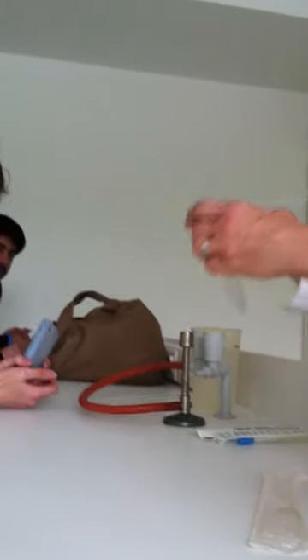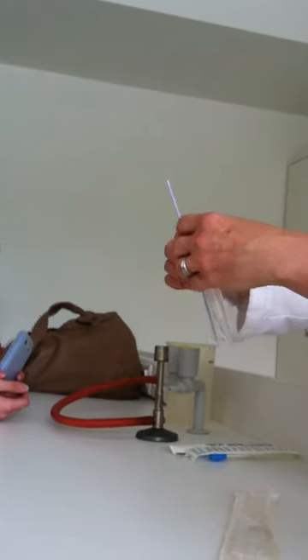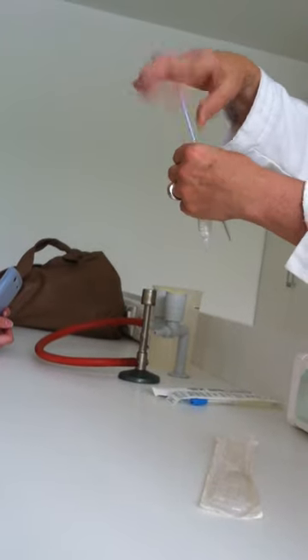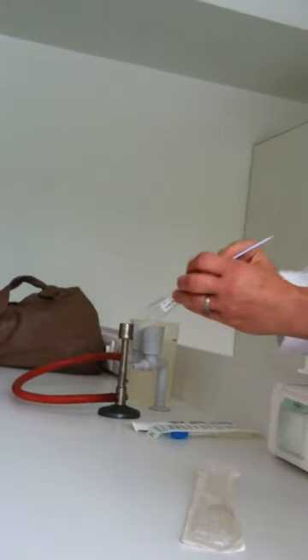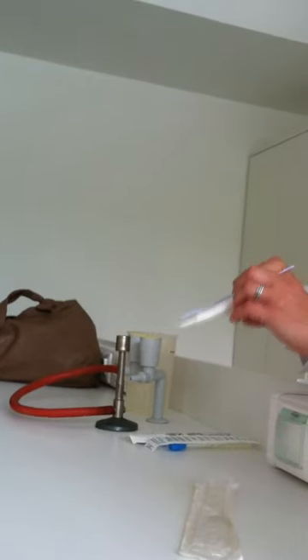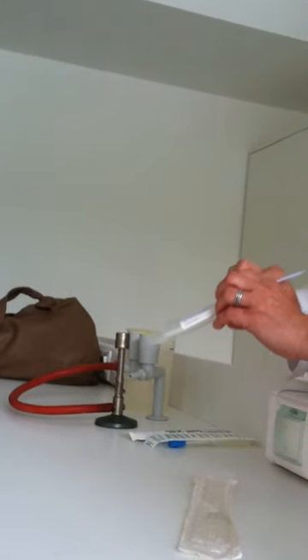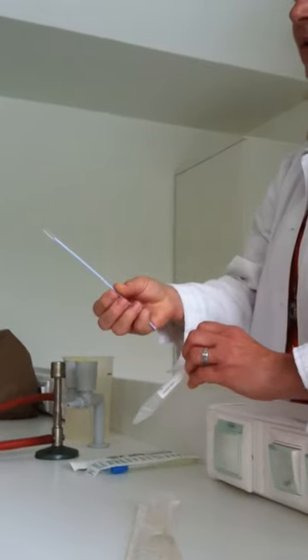And then you should put it into this homemade transport medium. Of course, this is longer, but you can break it very easily, and you can put it into this special solution. This is for chlamydia or human papillomavirus. So the reason is collection of cells by this cytobrush.